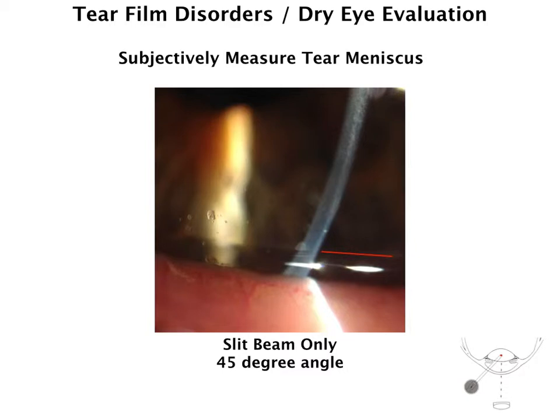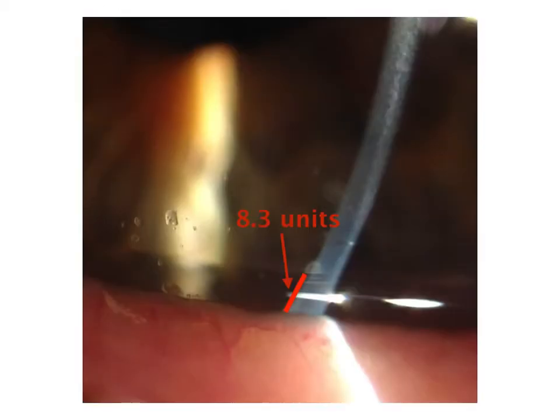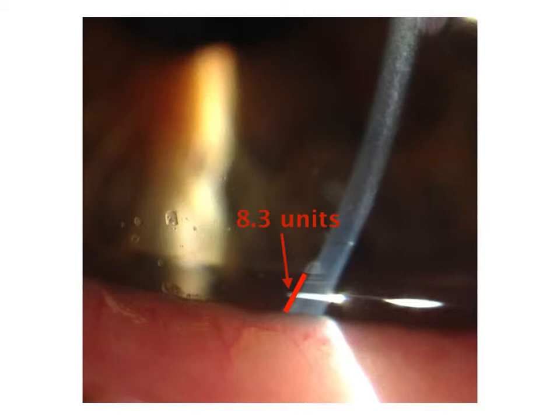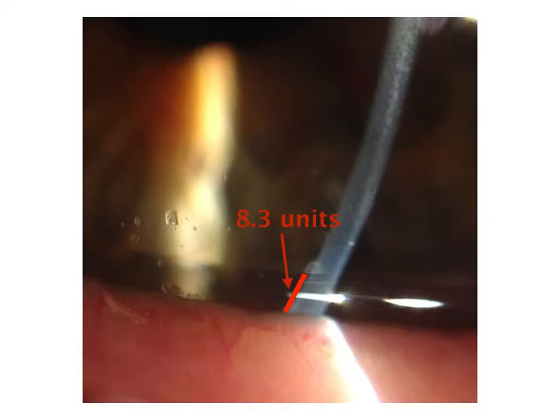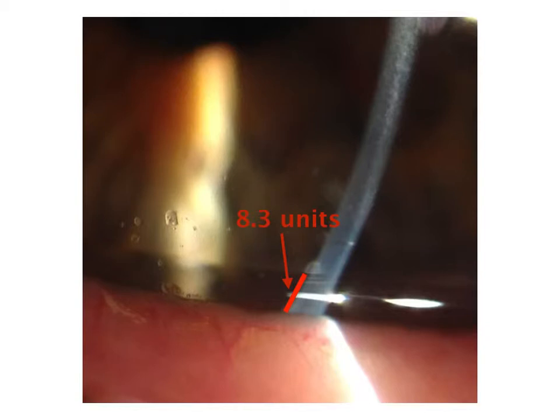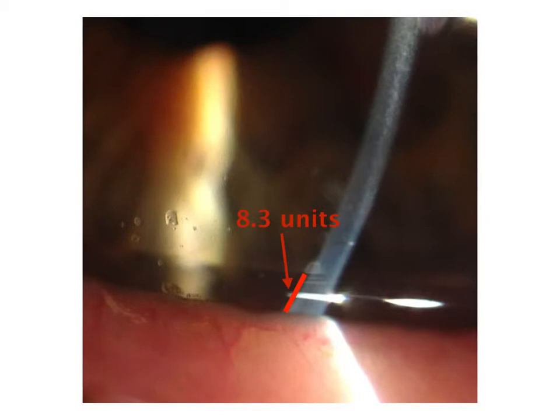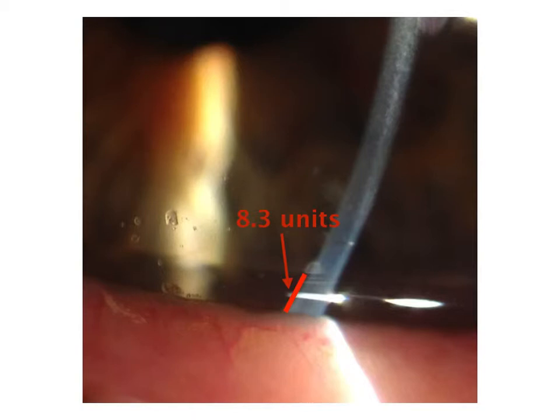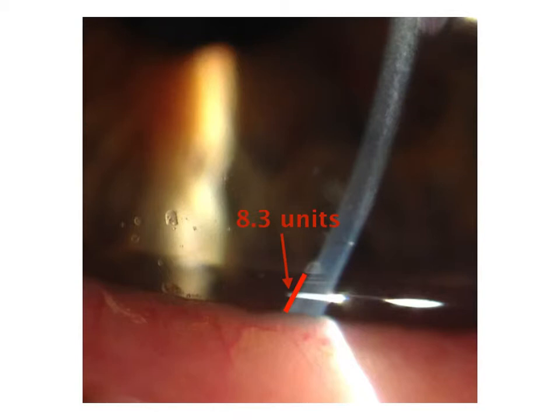This is good for a subjective measurement. However, it's always important to try to objectify measurements so we can look at change over time. Using some programs on a smart device, Mac, or PC, you can measure the height of the tear meniscus — it's a completely arbitrary measurement in units, not millimeters or centimeters. In this case, the patient came in and we measured the tear meniscus as 8.3 units. On the next exam, we can remeasure it and see if there's been any change. For example, we could start them on artificial tears with castor oil and a secretagogue, and if it was at 10 units at the follow-up, we know there was a significant change in their tear meniscus, most likely as a result of the treatment.